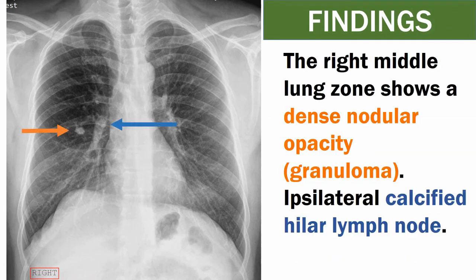Let's see the chest x-ray findings. The right middle lung zone shows a dense nodular opacity, which is a granuloma, and there is also ipsilateral calcified hilar lymph node.